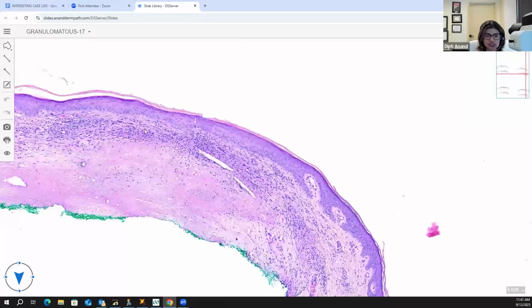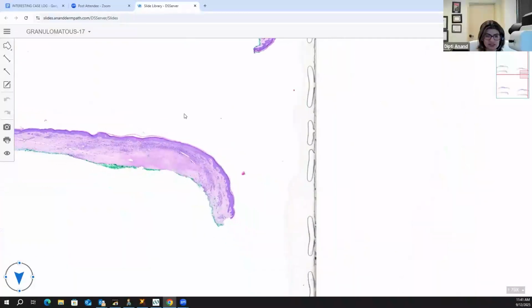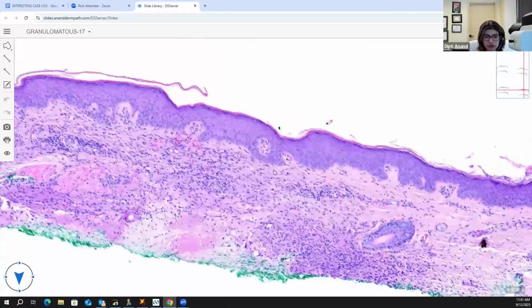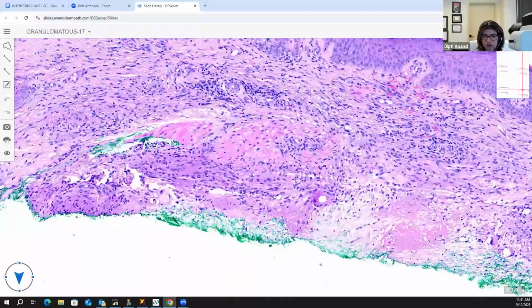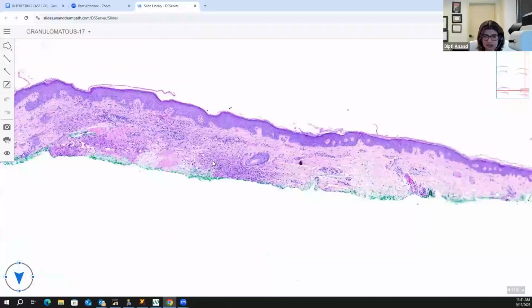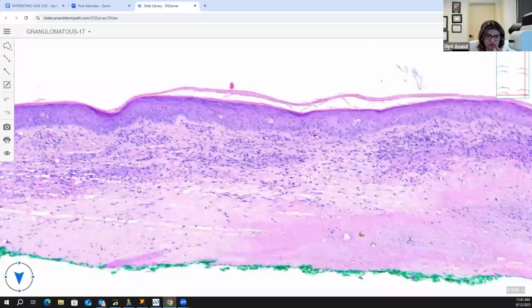And then suddenly you notice again these shreds and spaces in the tissue. These are very consequential when you're seeing a granulomatous lesion. Things like holes and spaces is what you should pay your attention to because they may be hiding something where the answer is really obvious. And then when you go into all the levels, these are true holes and spaces. You see how the piece of the tissue is broken apart. And then there's actually a foreign body stuck in here. There is a really obvious foreign body in one of these places here.